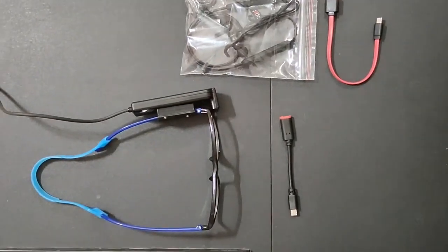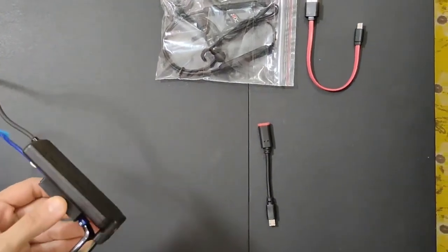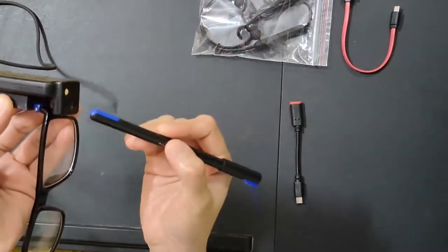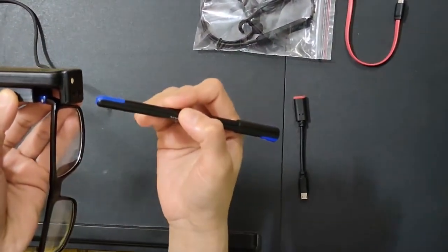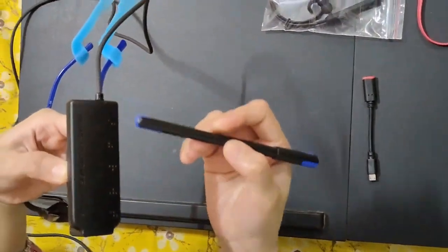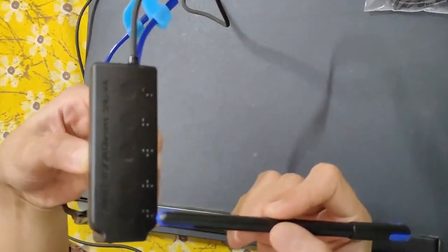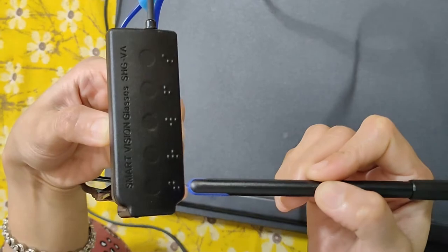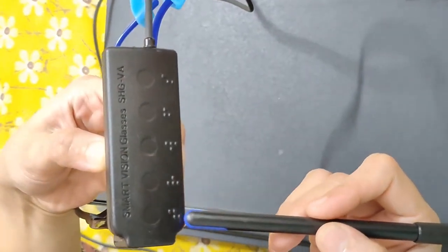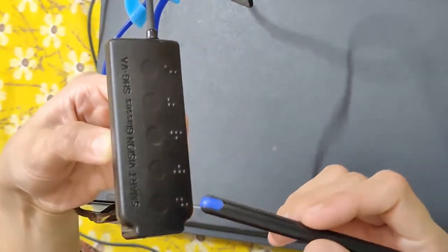Let me show you the functions available with the smart vision glasses. On the left-hand side there is a sensor, and the camera is present on the left side temple. The functions are mentioned in braille. There are 5 knobs or 5 functions. The first one is marked with the letter T in braille — once you tap this button it will describe the things around you.